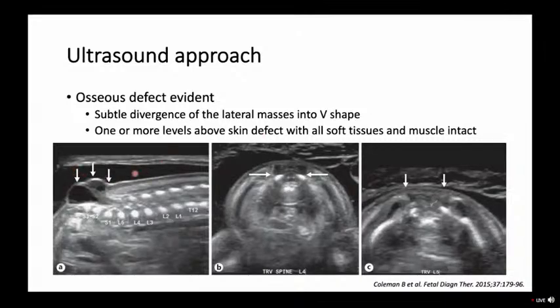This is a good image because you see the fluid in between the fetal skin and the uterus. This is an acceptable one. This is not great because you see the uterus and the skin edge. Don't push so hard. Let a little pressure off on the transducer. See if you can get some space, some fluid in between the baby and that uterus.